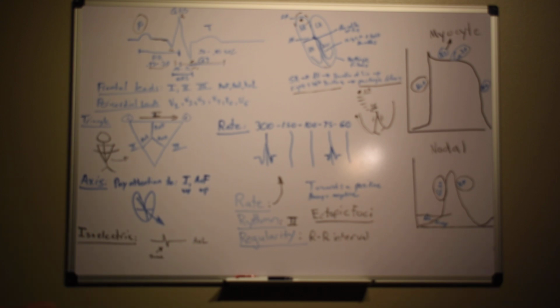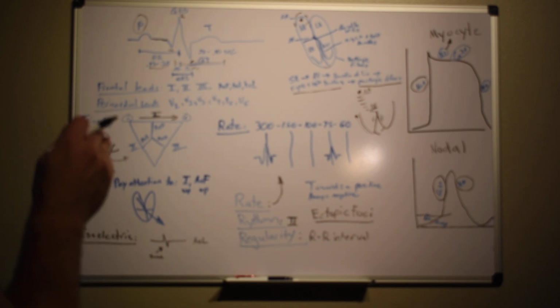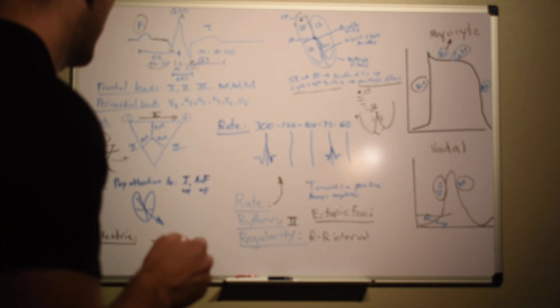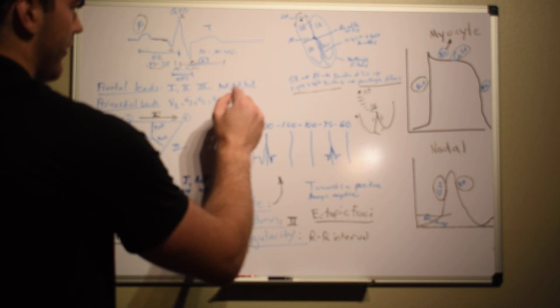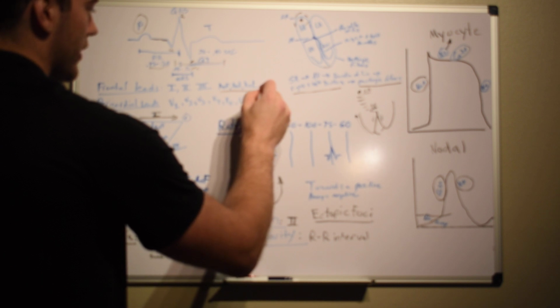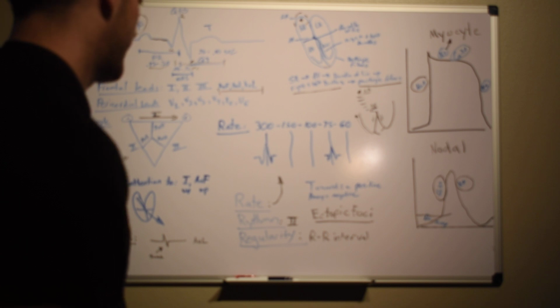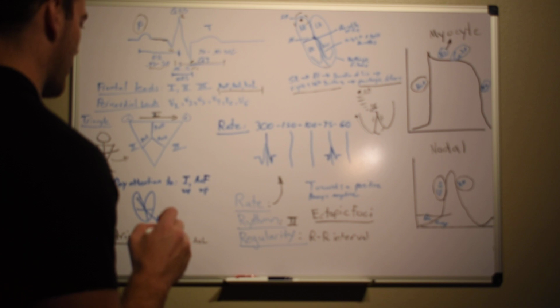Okay, so that's all good and well. We have pairs of leads in our 12-lead EKG. The first 6 leads are the frontal leads. They're going to be looking at the heart from a frontal pattern, okay? So we've got I, II, III, aVF, aVR, and aVL, and these leads are computed. They're not actually specific electrodes on our skin, but we'll see how it all works out.